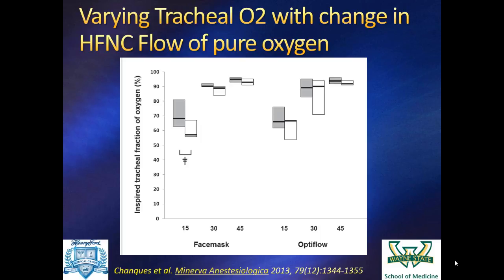And so the math whizzes in the room, if you use a regular nasal cannula at 15 liters per minute, what do you think is your delivered FiO2? 60 plus 21. So it's 81, right? That's probably no worse than that, but no better.